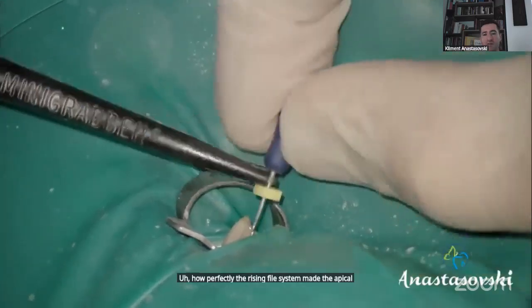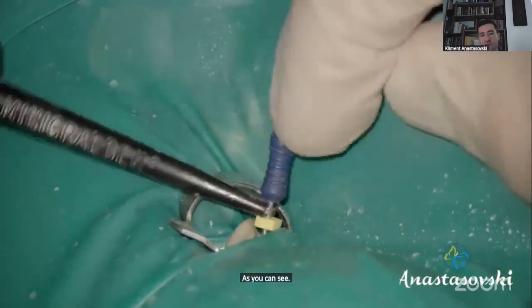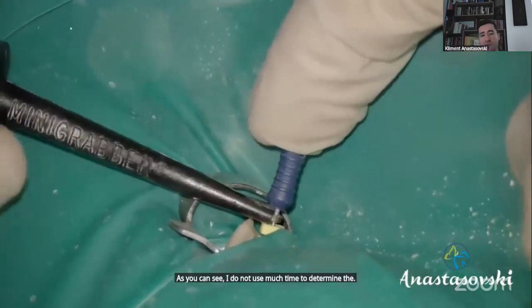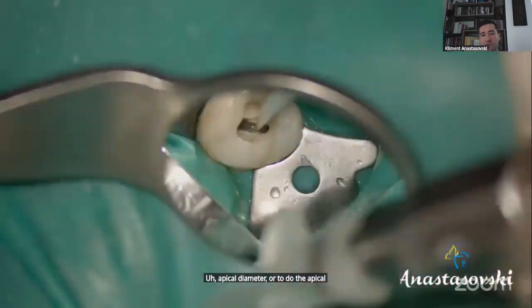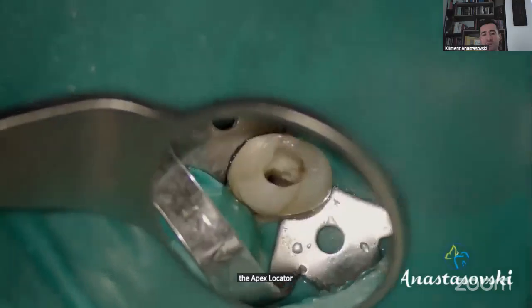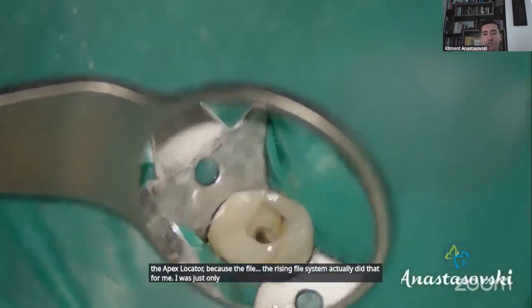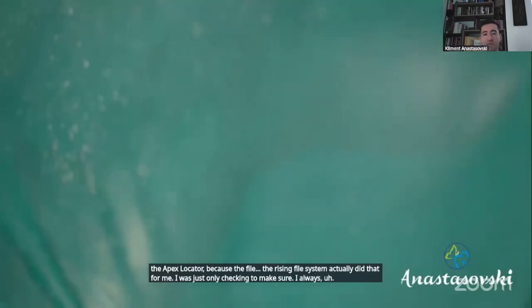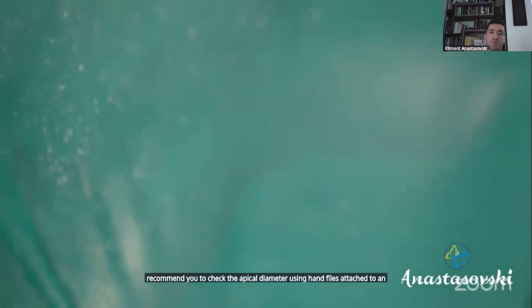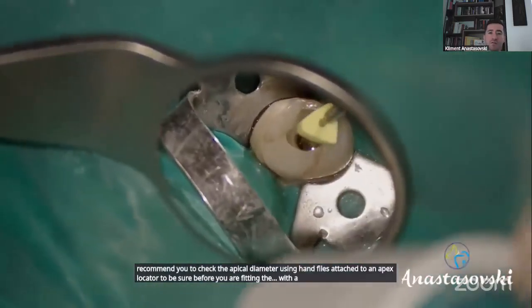As I said, their design at the apical part. As you can see, I do not use much time to determine the apical diameter or to do the apical gauging of the files using the hand file and the apex locator, because the RISING file system actually did that for me. I was just checking to make sure. I always recommend you check the apical diameter using hand files attached to an apex locator to be sure before you are fitting the gutta-percha cone before the obturation.